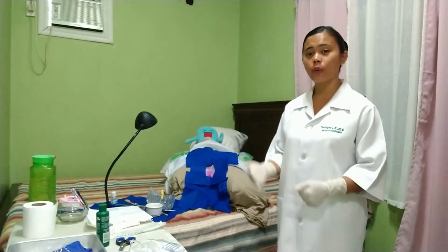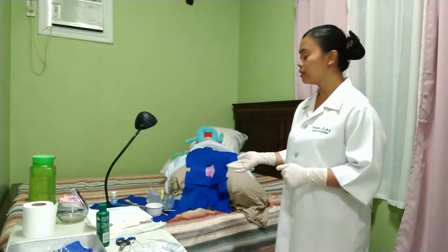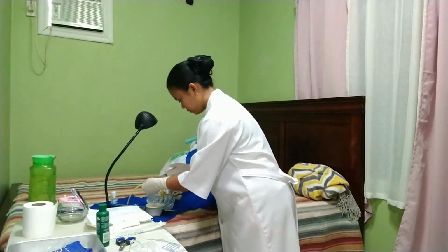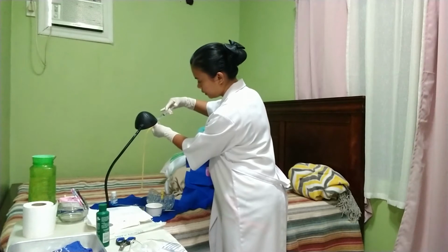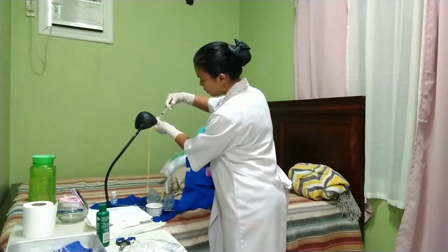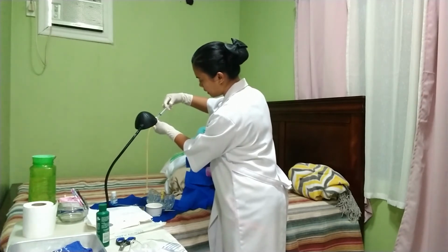Next step is to test our catheter kit to check if it's free from any defects. Using our pre-filled syringe, 5 ml of sterile water, now the catheter's capacity for water is from 5 to 15 ml of water. So if we inject slowly the sterile water, it should not disrupt the balloon. Otherwise, it must be defective and we have to replace it.